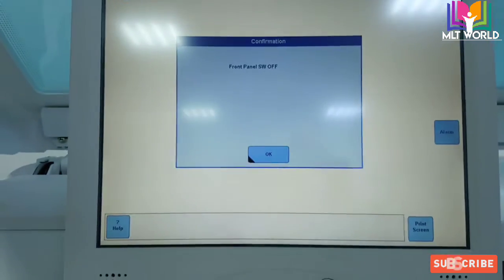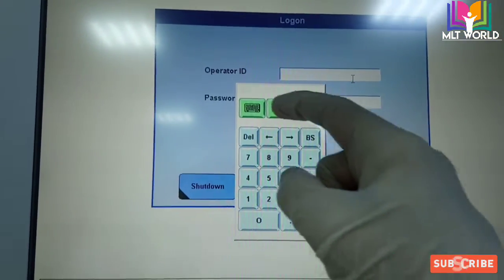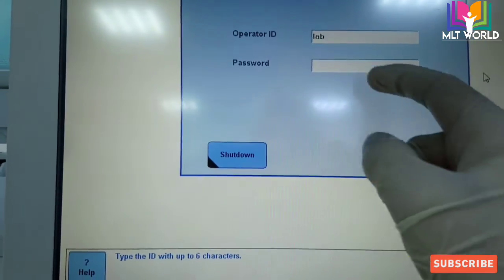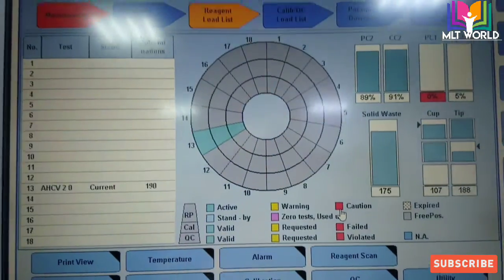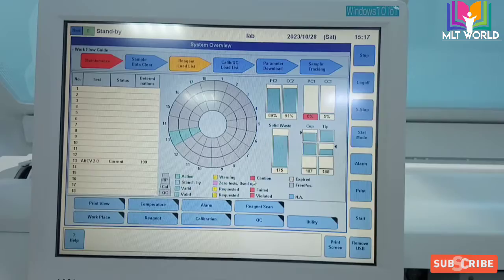You can see it says 'front panel switch off,' so we will switch on this operation button. After that, on the level screen we will click OK. Then the machine will ask for the password — we will enter 'lab' and 'lab' as the username and password, though other hospitals may have different credentials. We will then log on to the machine, and the main display screen will appear.